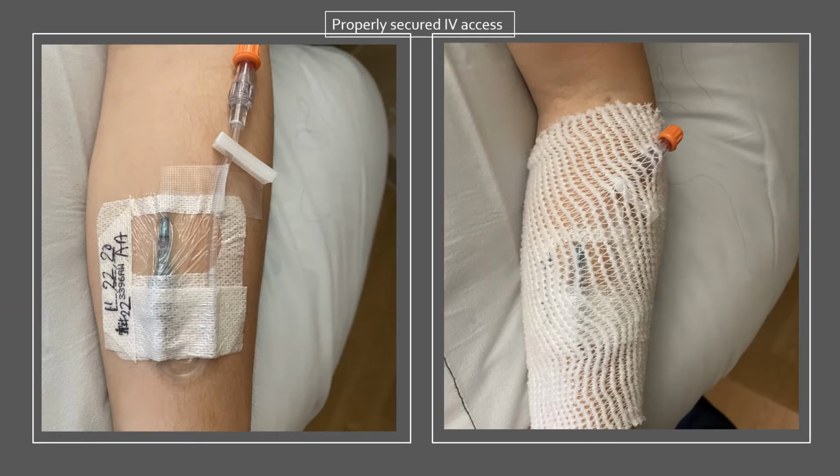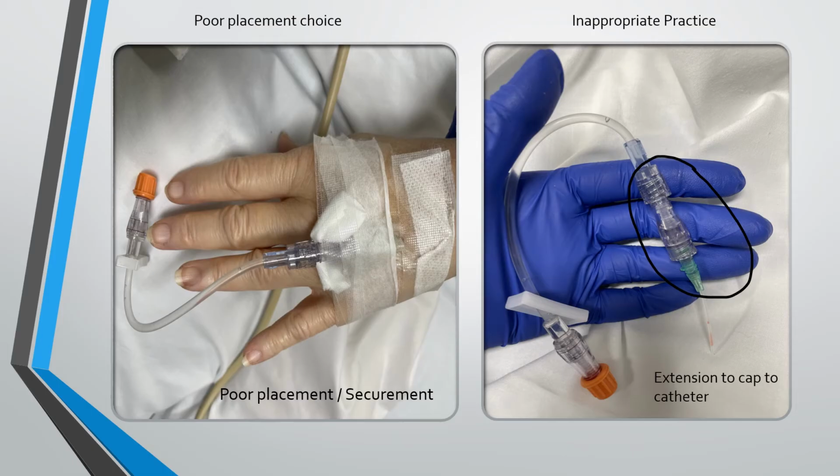These 2 slides depict a properly secured IV catheter. This first slide depicts poor IV catheter placement and securement. Therefore, this catheter will not last very long. The second slide depicts improper practice with an added extension cap, increasing the risk for contamination.